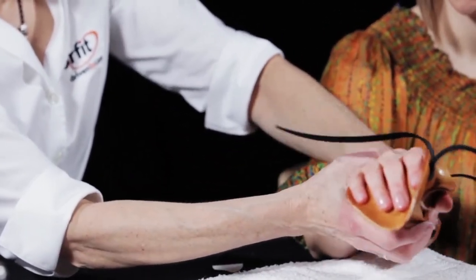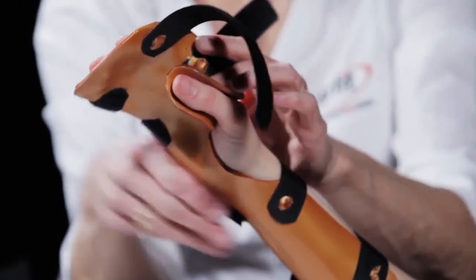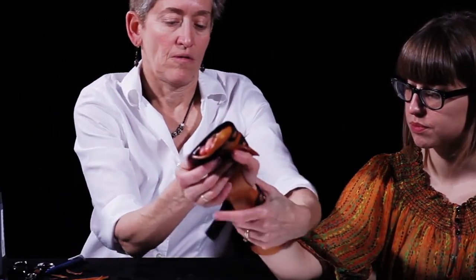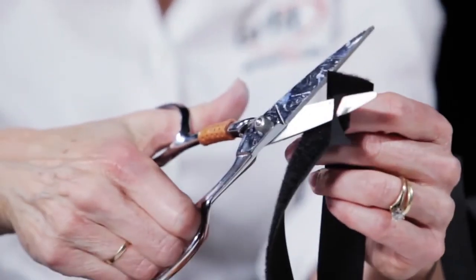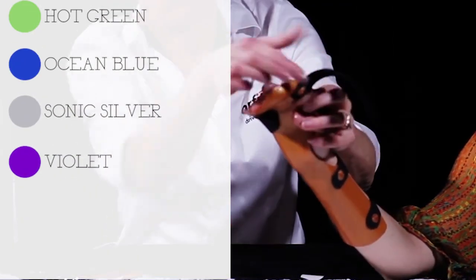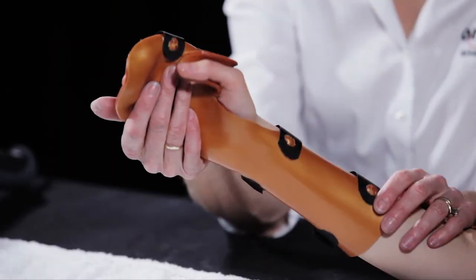Place the orthosis back on the patient to check the fit and trim the straps. The orthosis should secure the wrist in slight extension and the thumb in wide abduction while allowing the fingers to rest in slight flexion. Using Orfit Colors NS in all color choices allows you to make bright and bold therapeutic orthoses which your patients will enjoy wearing.